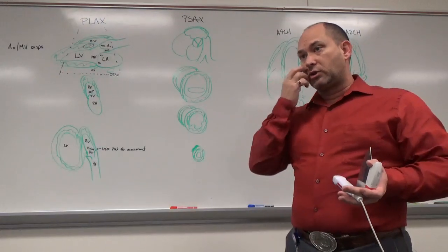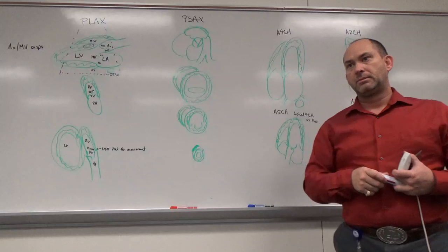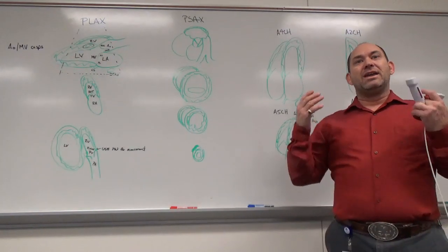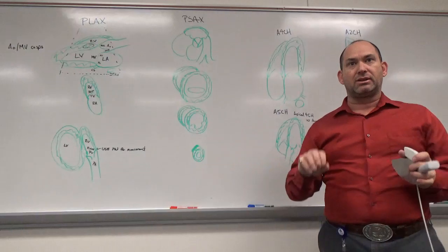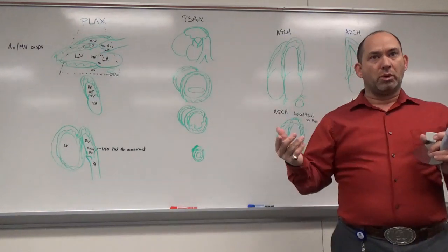How do you know when you have a good window? From what you've experienced already, how do you know your window's better? You can actually see what you want. Yeah. So I call it pops out. You're scanning, and then all of a sudden, without me changing any gains or anything like that, the view just, boom, there it is. You know when you have a good window.